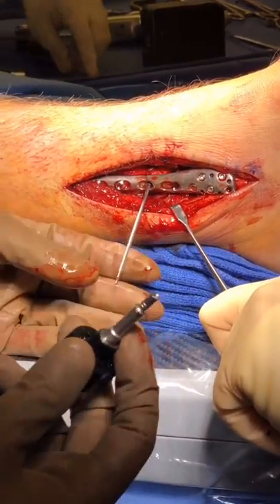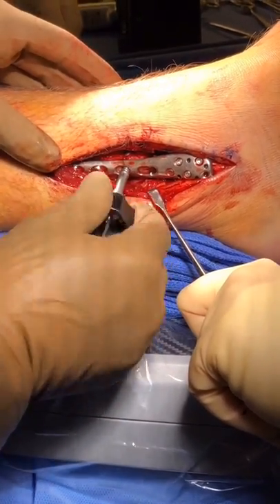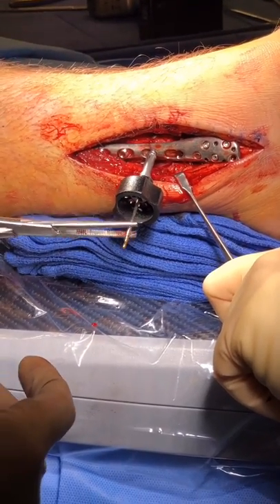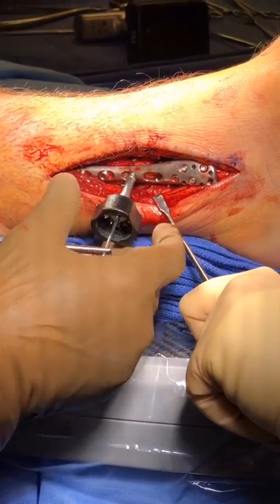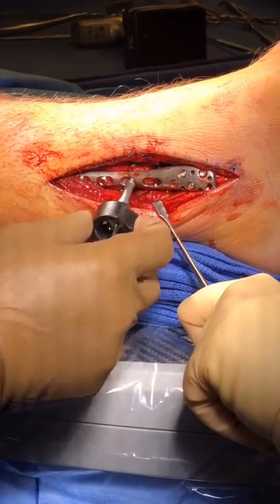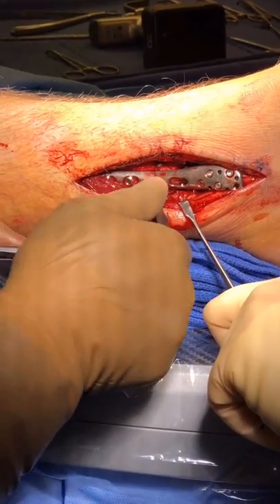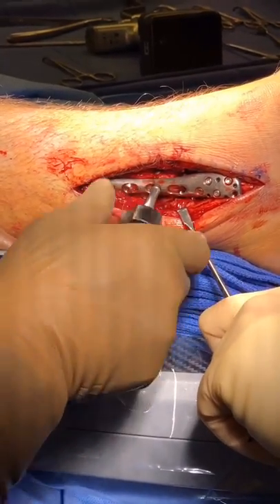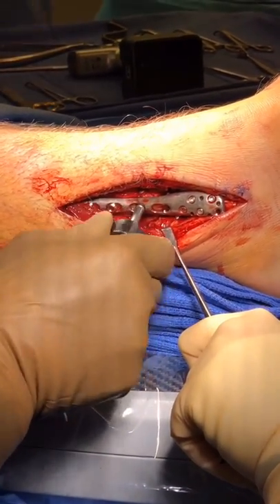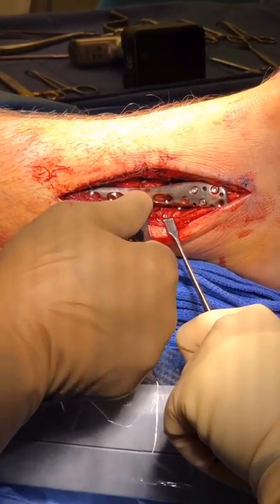We will place the short fibular button over the wire. We'll take a hemostat and pull back to engage the threads of the fibular button with the Fibulink. And then we'll simply advance by turning clockwise to our desired level of tension.